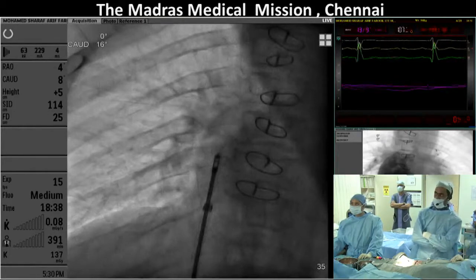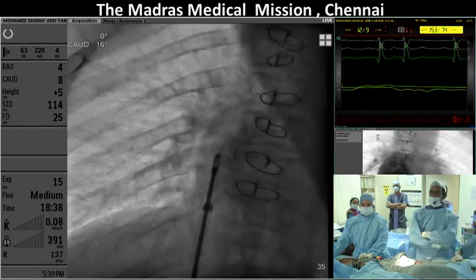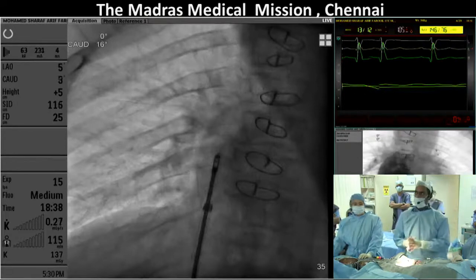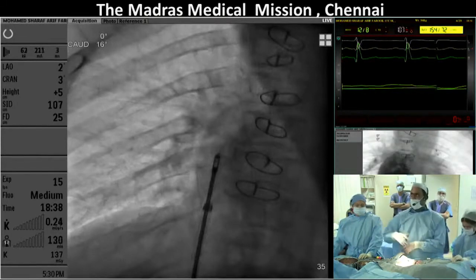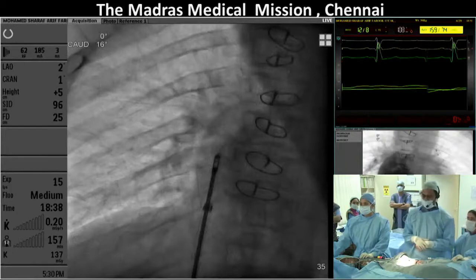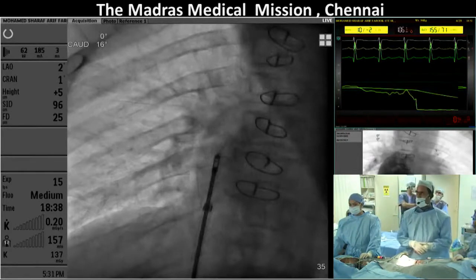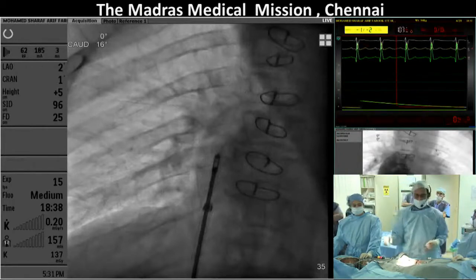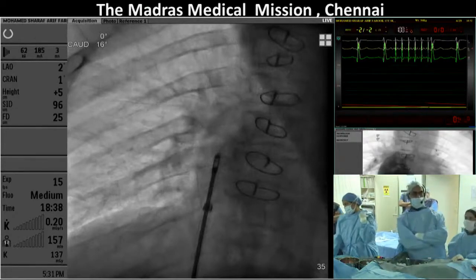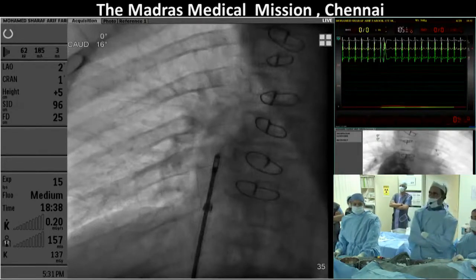The Fontan pressures. What is it now? What are the Fontan pressures reading now that you have the device deployed but not released? Not released, and now we are having not much of elevation. It's somewhere around 13, 12 to 13. It's between the 10 and the 15 lines. Zero it once again, properly zero. When we made a complete balloon occlusion, the Fontan pressures went up to 16, but now with this fenestration on, it is currently around 13.